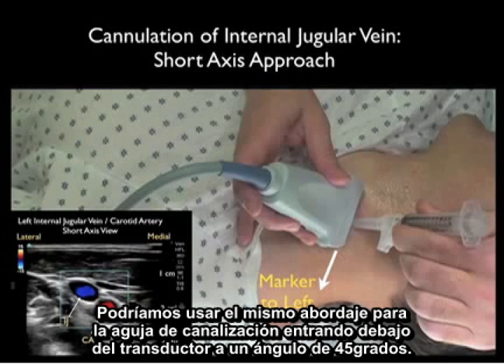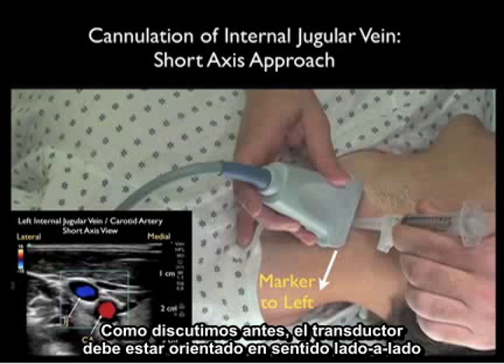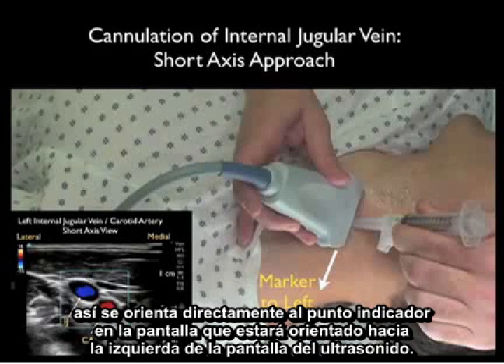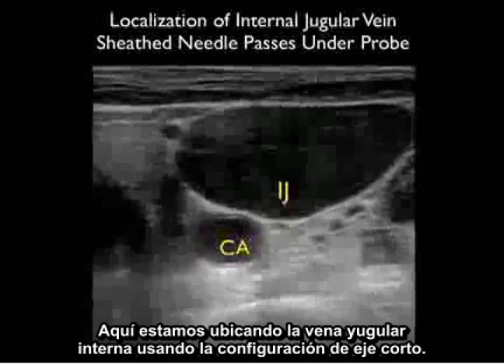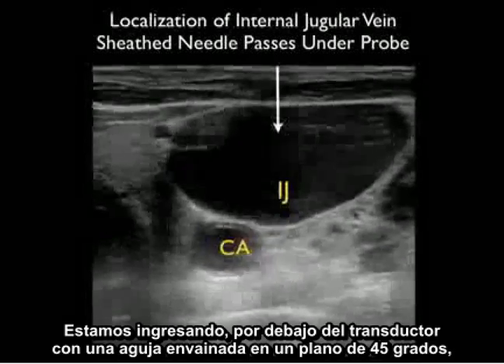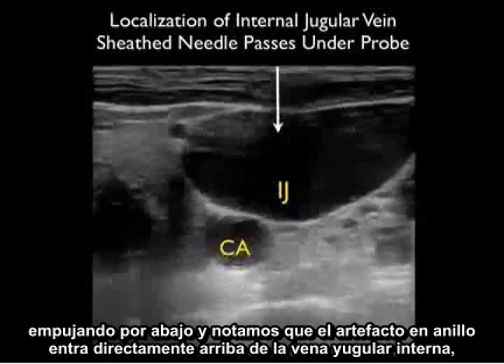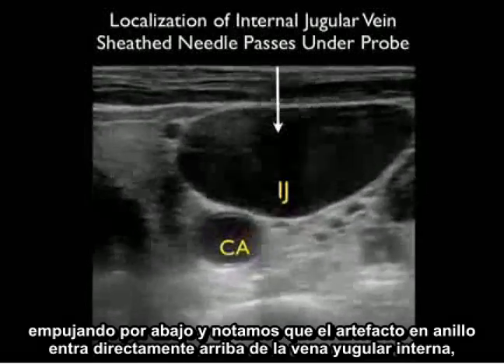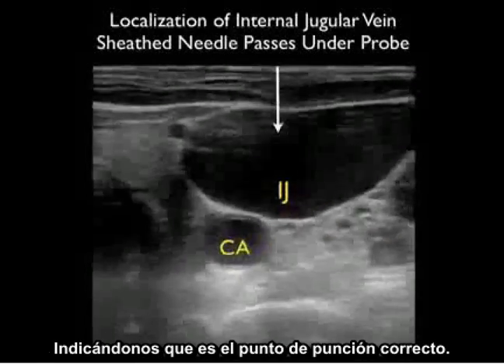We would use the same approach for the cannulating needle coming in underneath the probe at a 45 degree angle. The probe should be oriented in a side-to-side orientation with the marker down towards our left as we stand at the head of the bed, orienting to the screen indicator dot towards the left of the ultrasound screen. Here we're localizing the internal jugular vein using this short axis configuration, coming in underneath the probe with the sheath needle at that 45 degree plane, and notice the ring-down artifact coming in directly on top of that internal jugular vein, telling us this is the correct puncture point.